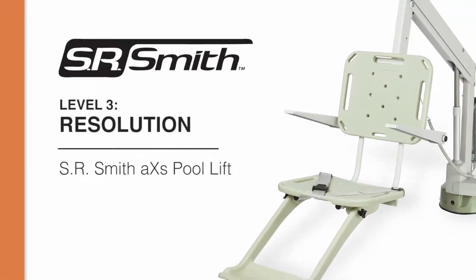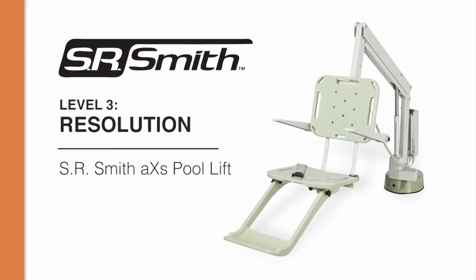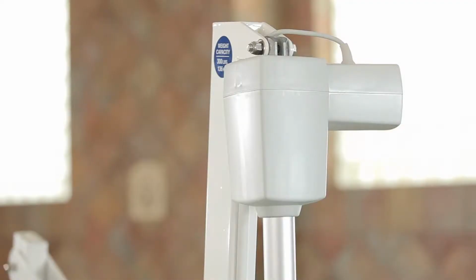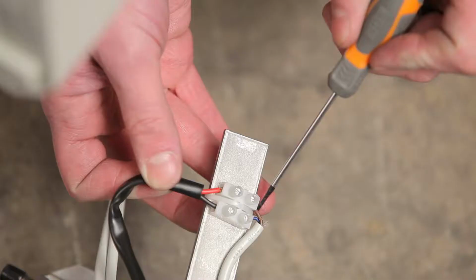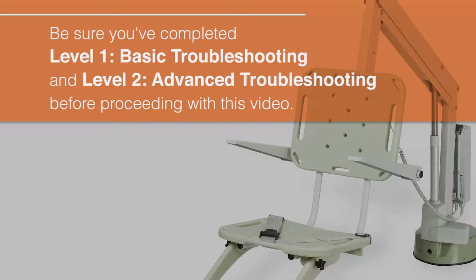In this video, we will show you how to remove and replace key components in your lift. These components include the control box, the actuator, actuator cable, motor assembly, and the gears. Please make sure you have completed the Level 1 and Level 2 videos before proceeding with this video.